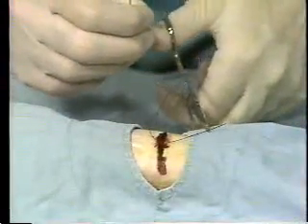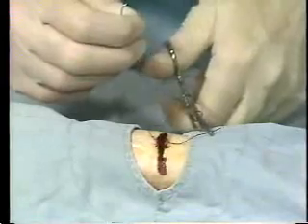Wrap the suture around the needle holder 3 times in a clockwise direction. Grasp the free end of the suture in the needle holder. The needle holder always grasps the free short end for tying.